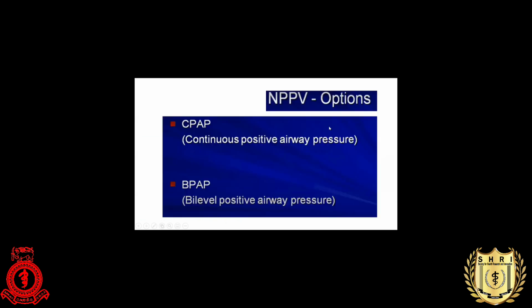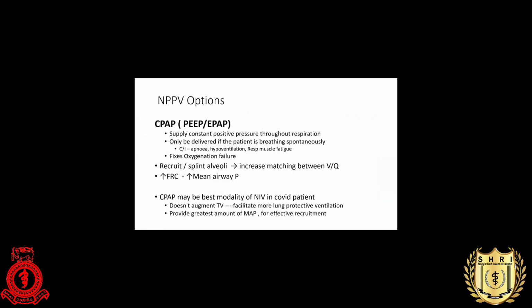Okay. As I mentioned earlier, there are two modalities in non-invasive positive pressure ventilation. One is continuous positive airway pressure, another one is BiPAP. So what is this?